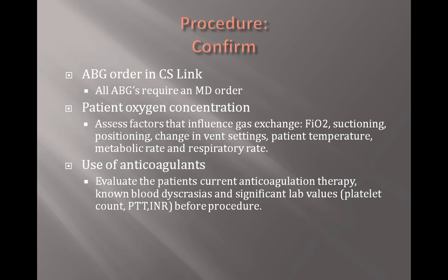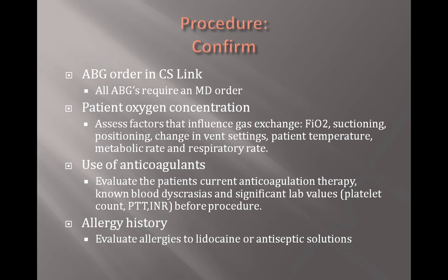Ask yourself if the patient has any bleeding risks. If so, grab an extra 4x4 from your nurse server along with your ABG kit and allow some extra time to be certain to achieve hemostasis post-puncture. Be aware of any allergies and limit exposures.